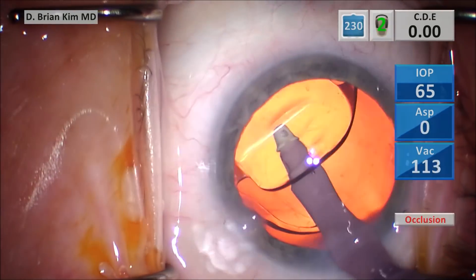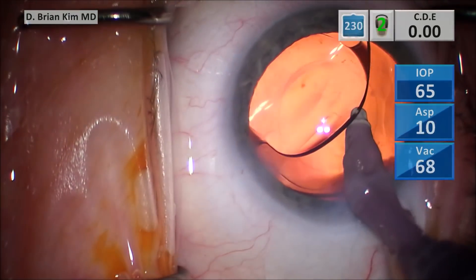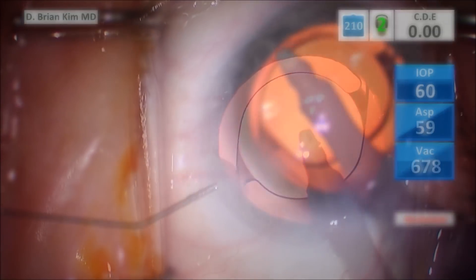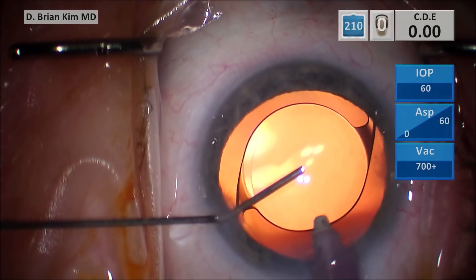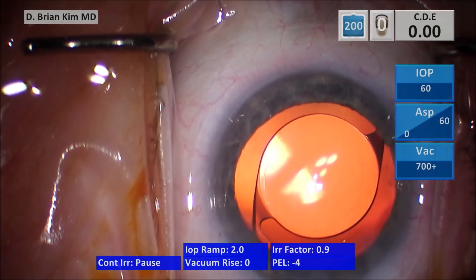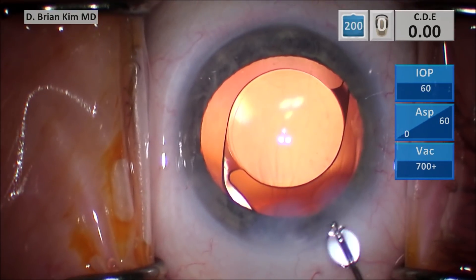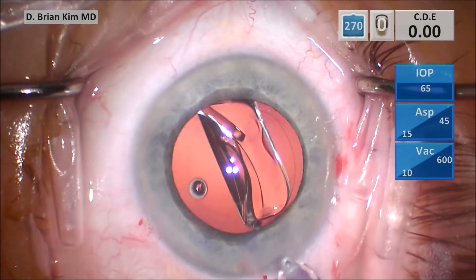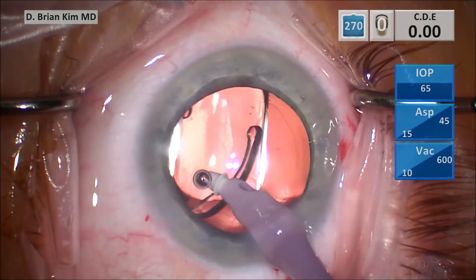You're going underneath the bag, removing all the viscoelastic and any lens epithelial cells from underneath the bag. Because the optic is pushed up into the capsular fornix and you can see it's not being pushed from side to side, that tells you that each of the haptics are also within the bag. I'm performing this fluid exchange, which prevents the anterior chamber from collapsing, and then you hydrate your incisions. The dialing of the lens is very important — as you can see, the dialing is very smooth. When you get underneath the lens and push on the left side of the optic, the lens dials in very nicely, ensuring that the haptics are indeed within the bag, because if they weren't, it would get hung up.